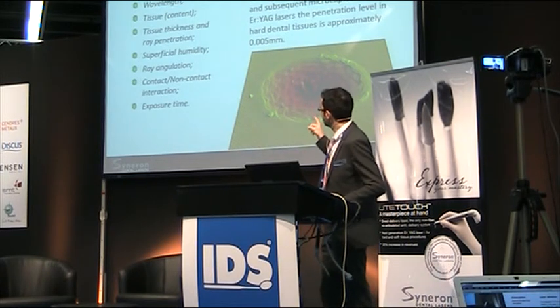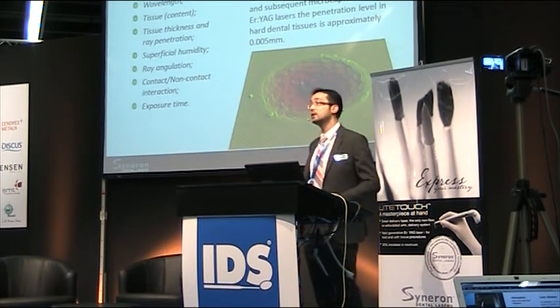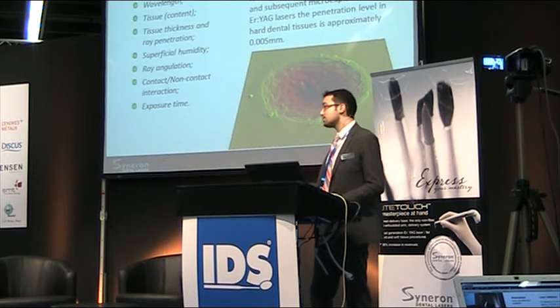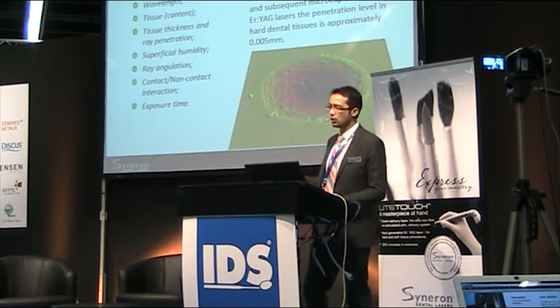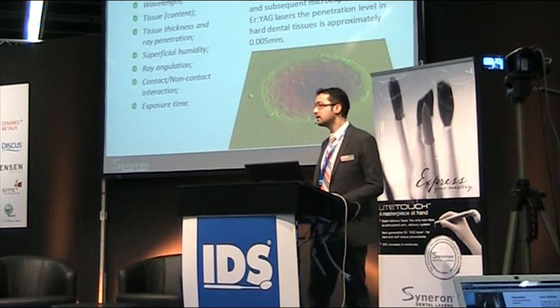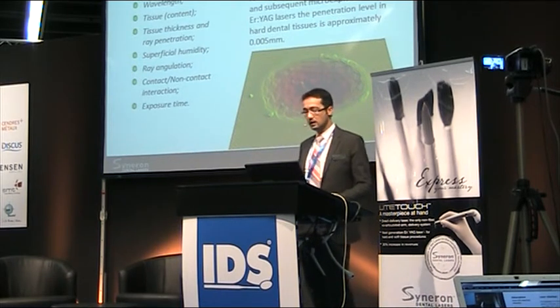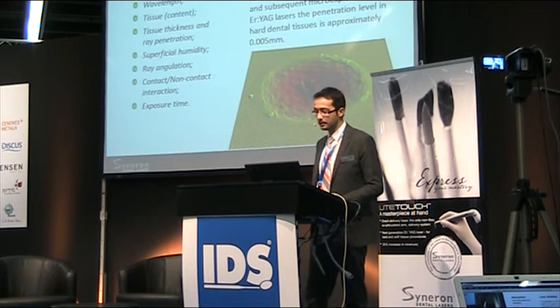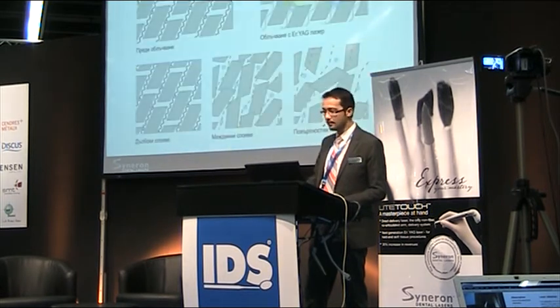And on this 3D chart you can see a cavity prepared with a laser. Of course, the absorption depends on different factors: wavelength, the content of the tissue, thickness and ray penetration, superficial humidity is best for cutting, the ray angulation, contact or non-contact interaction, and exposure time.